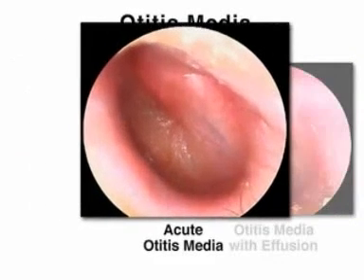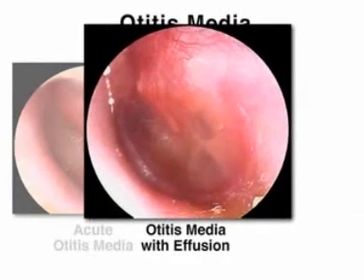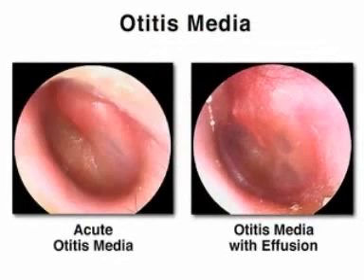In general, acute otitis media is diagnosed when the tympanic membrane is bulging, and otitis media with effusion is diagnosed when the tympanic membrane is neutral or retracted.